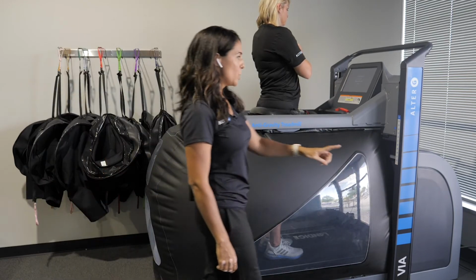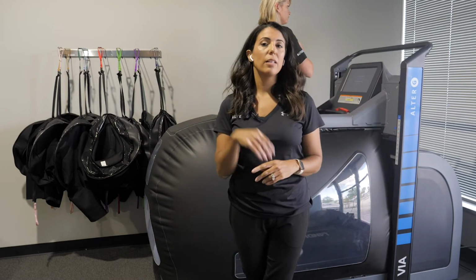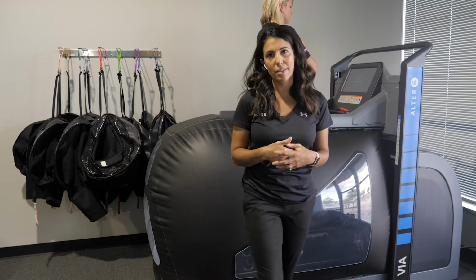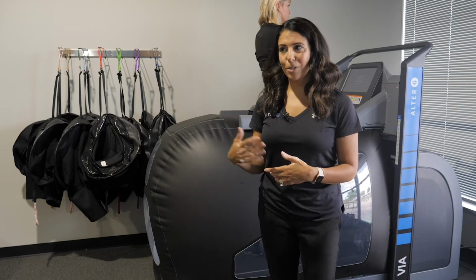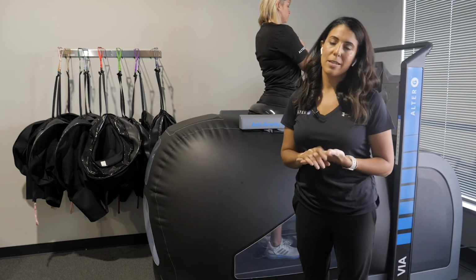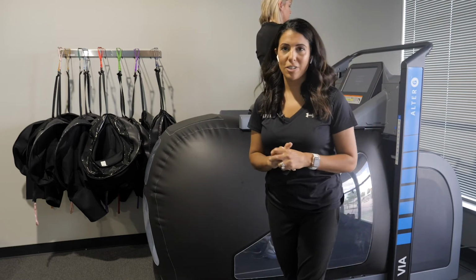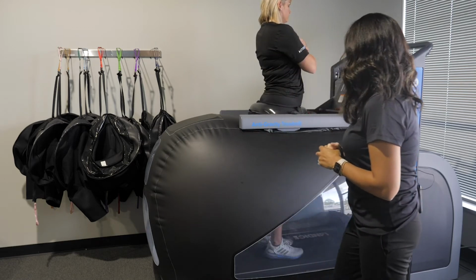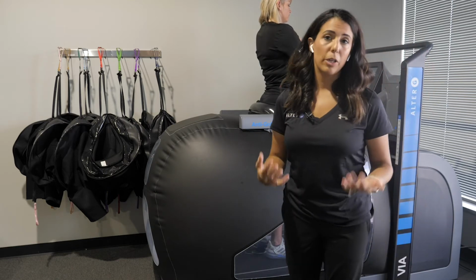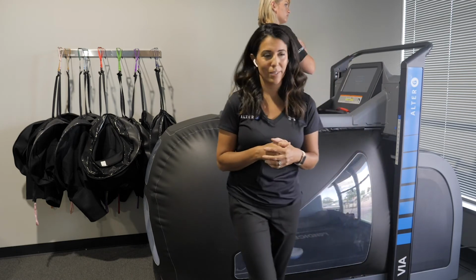While it's doing that, I'll just point out too that there are still markers on the side stanchions that allow you to mark the positioning of the frame per patient for that consistency of treatment. So should somebody else start to see your patient, they can set up the treadmill with the exact parameters and the exact height, the exact short size to replicate those treatment sessions, session to session. So right now, it'll say it's building the calibration curve. Again, it's going to do this for every single user every time you use the device.